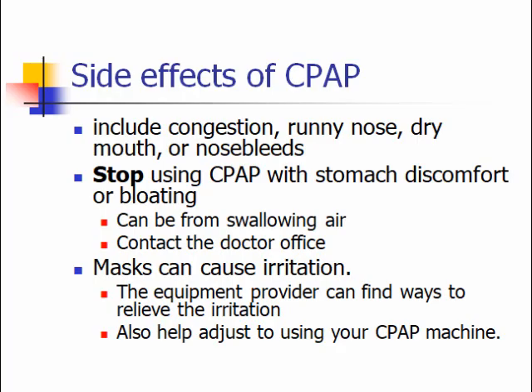Mask can cause irritation. Don't just put up with it. Contact the equipment provider because they can find ways to help relieve that irritation. Also, they can help you adjust to using the CPAP machine. Don't try it once and then give up. Give it time. Try and troubleshoot what you don't like about it.